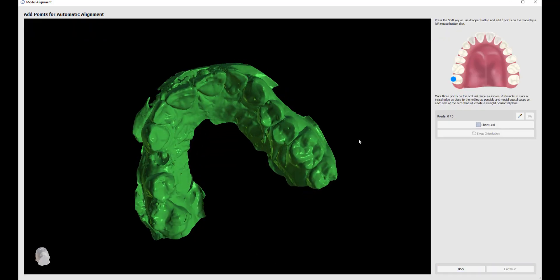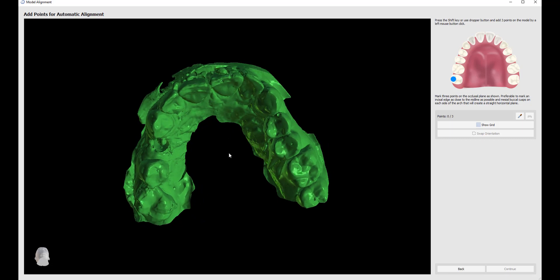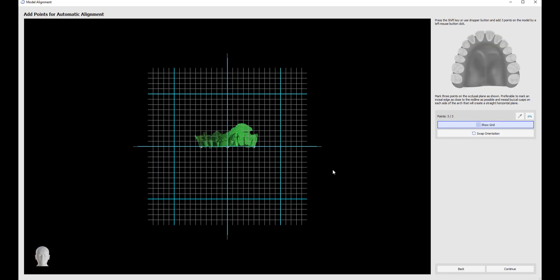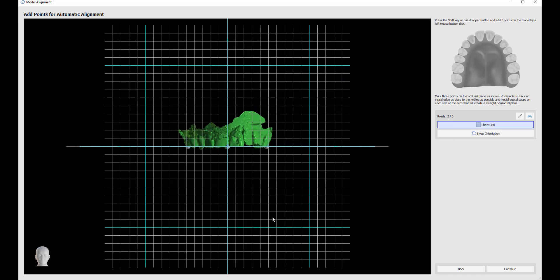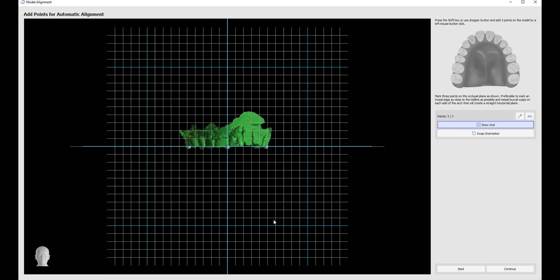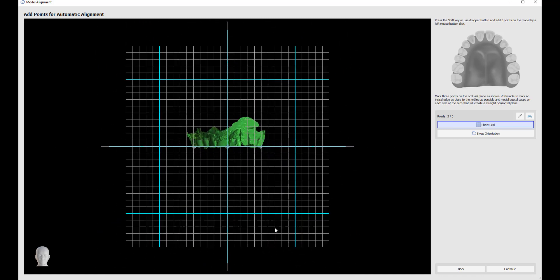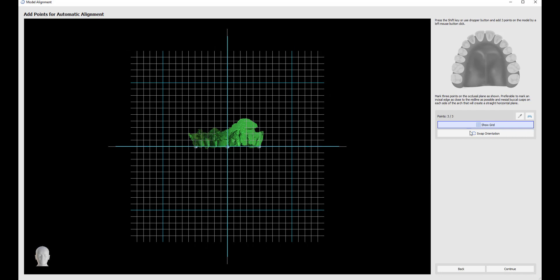What we're going to do now is place three points to create a horizontal plane. Hold down the shift key and left click to mark the points. Once all three points are marked, the software orients the model correctly in space and aligns it to a grid. We could zoom in and zoom out, holding down our right mouse button and moving the mouse backwards and forwards. Then we could click continue.